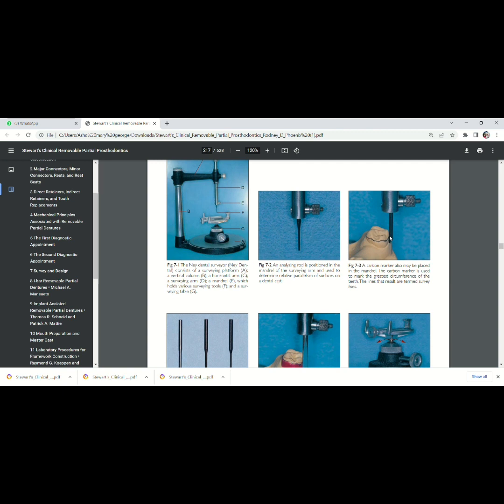The point where the analyzing rod is in contact with the tooth surface is called height of circumference or the height of contour, meaning the tooth surface with maximum convexity.